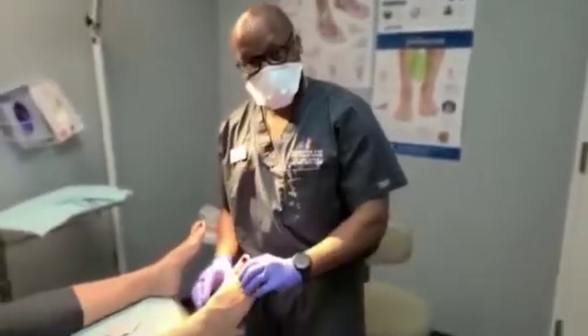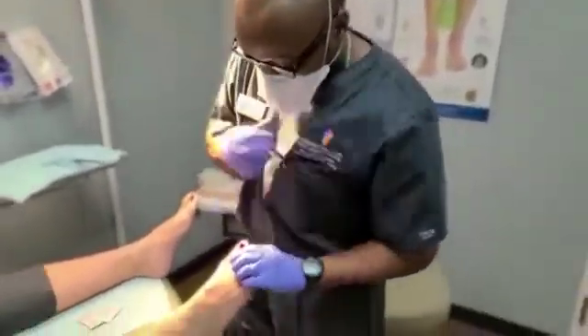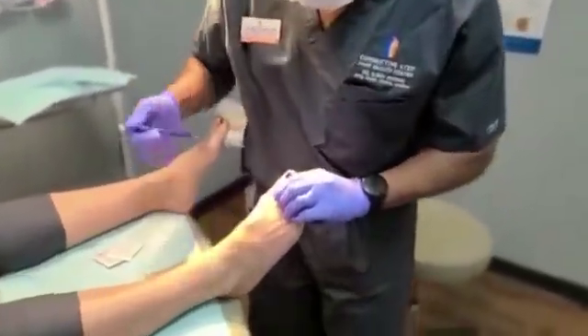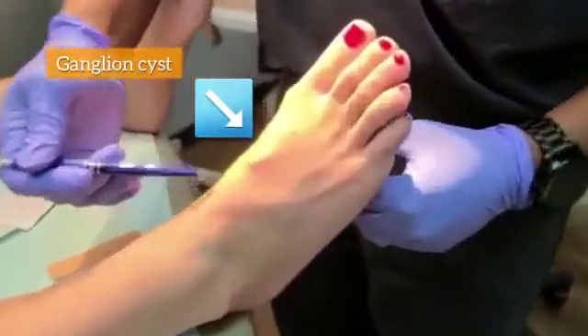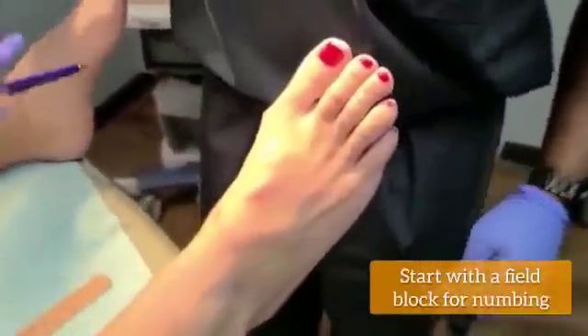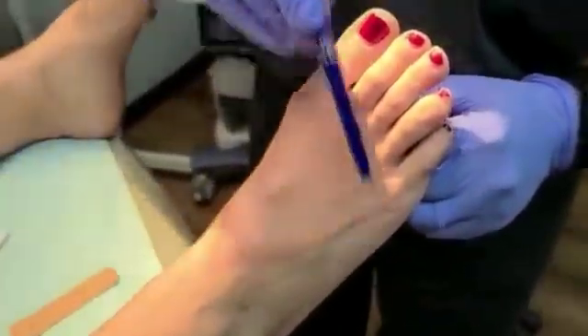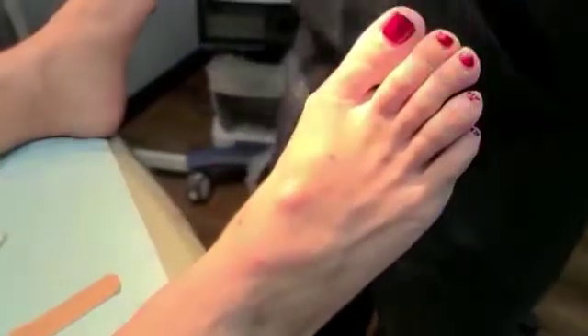We have a patient here who has a ganglion cyst. We're going to aspirate or drain it today. The cyst is marked out here with some dots. You may also see some red dots surrounding that — that's because we've done a field block. We've taken some local anesthetic and numbed the area all surrounding this ganglion cyst.